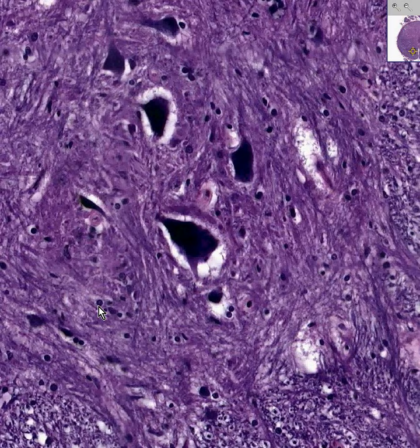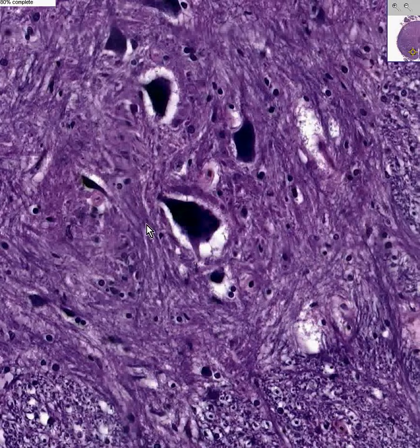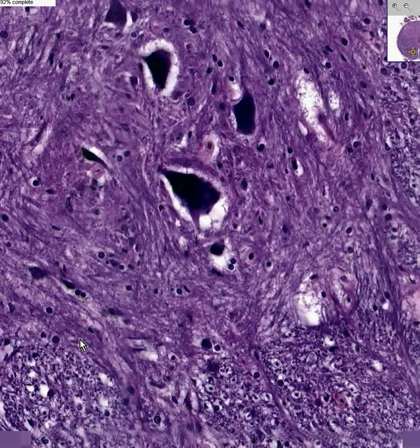Notice how we have an abundance of fibers throughout here. And then notice how there's a rather abrupt transition, and all of a sudden you're into an area in which there are no neurons, but nothing but the predominant cell being these cells which have a lot of white washed out myelin around them, and these are predominantly, if not entirely, oligodendrocytes, which are the insulation cells of the glial cells of the central nervous system.